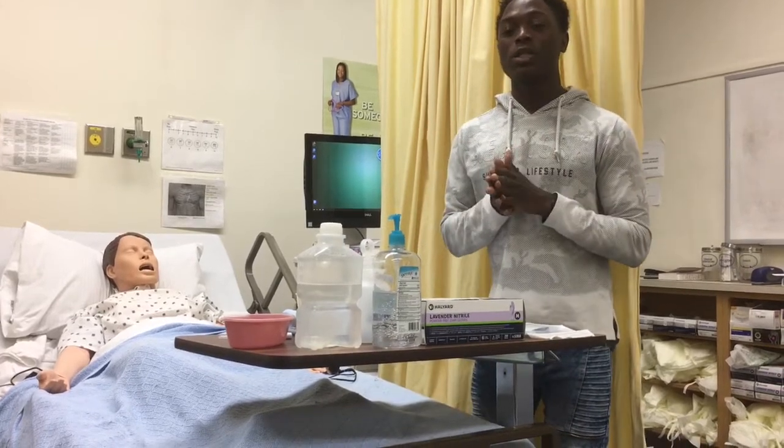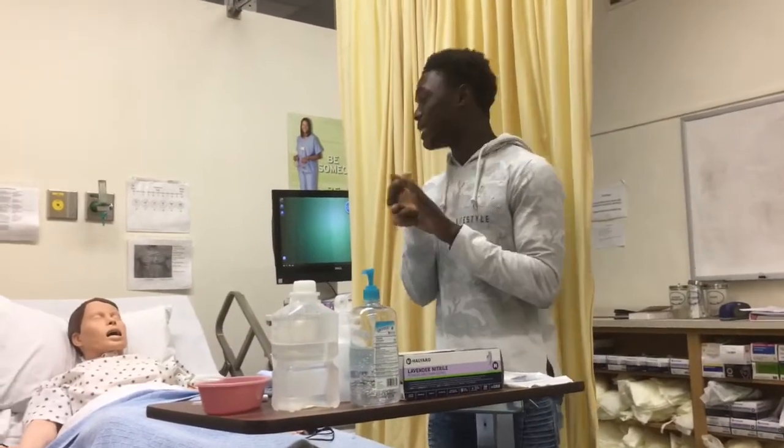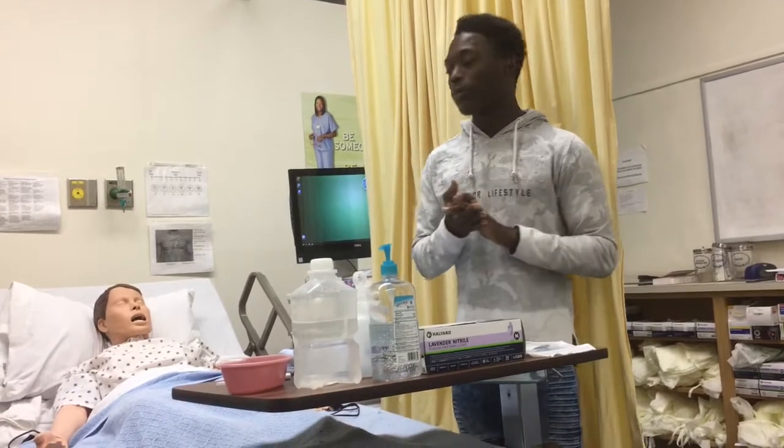In performing this procedure, before I begin, let me tell you what an NG tube is used for. It could be used for feeding or to insert medication for a patient that has difficulty swallowing, or you could use an NG tube to remove toxins.